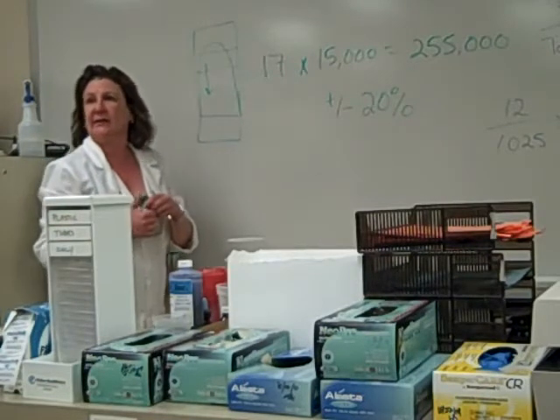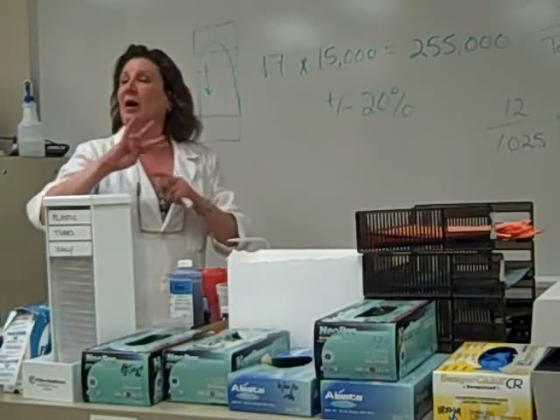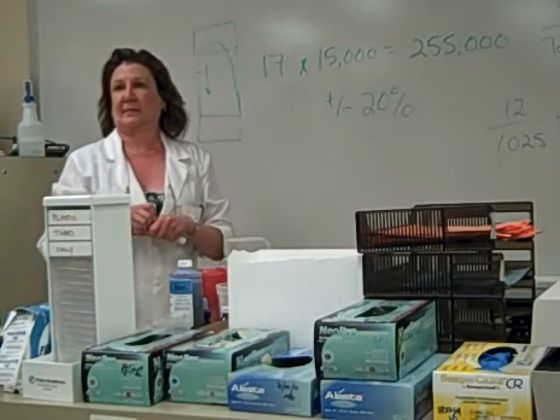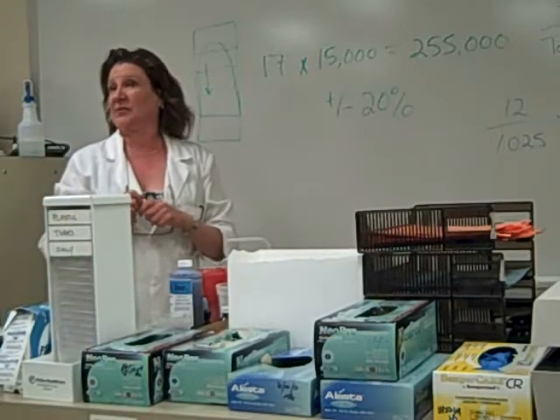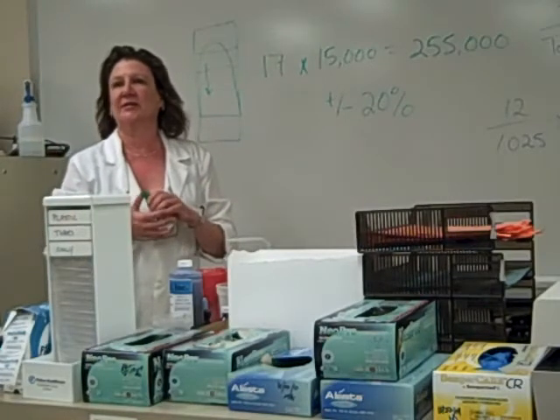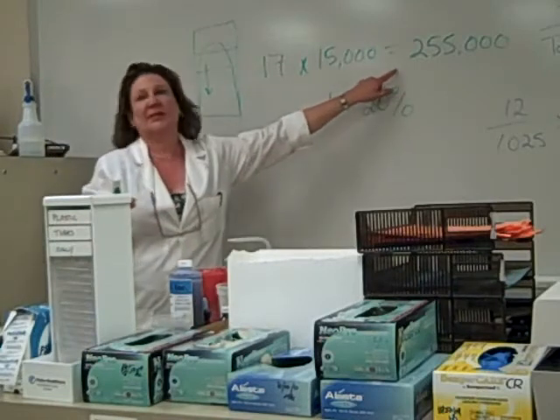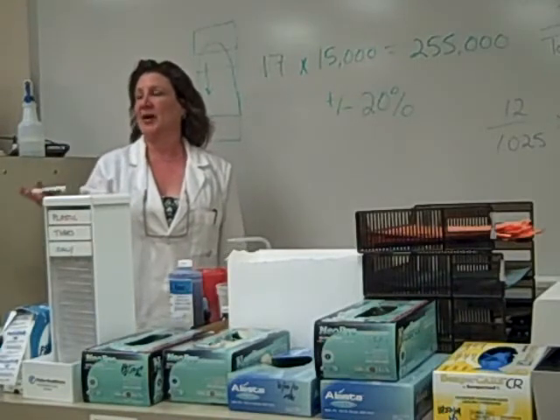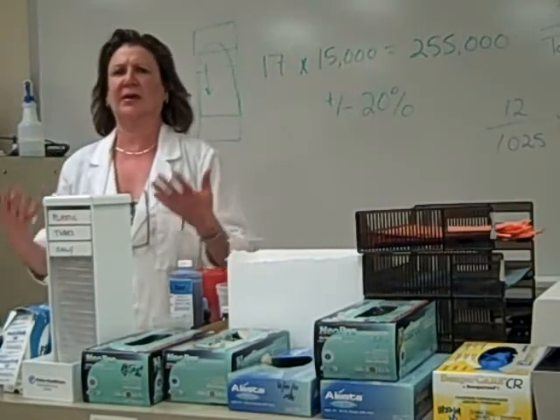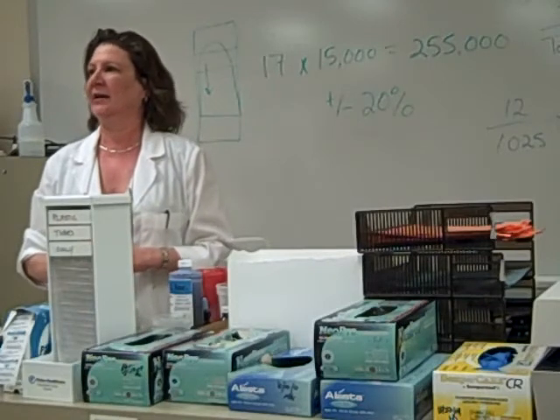Okay? Yeah, David. How many do I have to do? I want you to do a platelet estimate on all the diffs you do today. Okay, so it's going to vary. Some people may be close to being done. Other people may need more. But you've got to do the platelet estimate on the practical. So just make sure you feel comfortable and you're getting good platelet estimates. Any other questions?